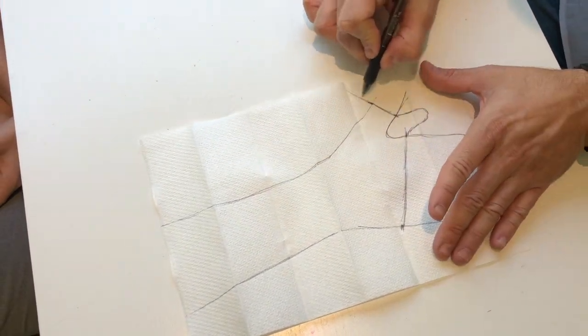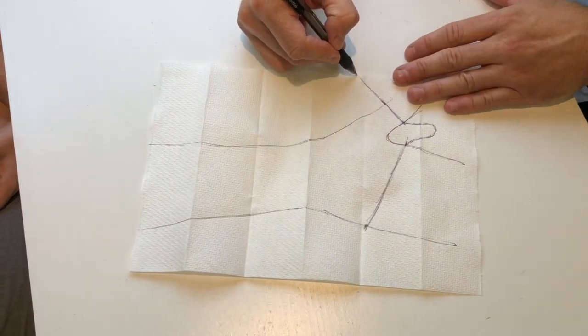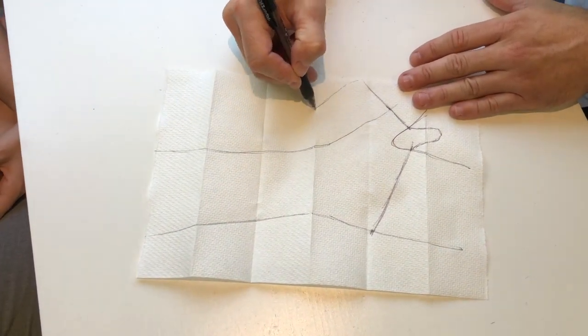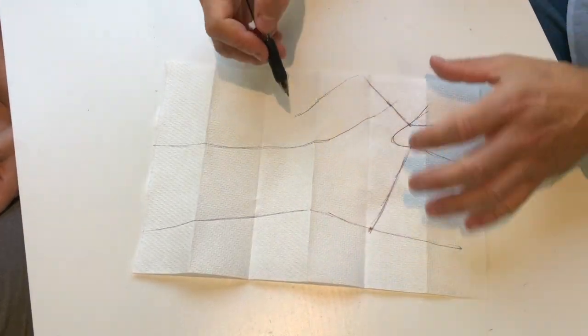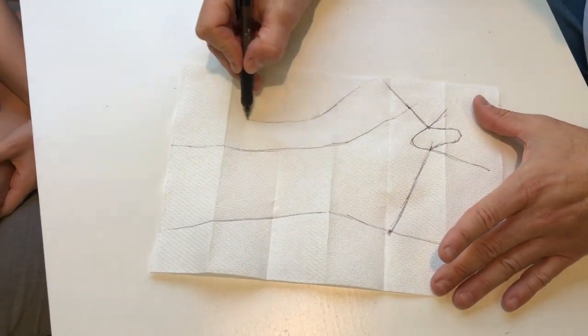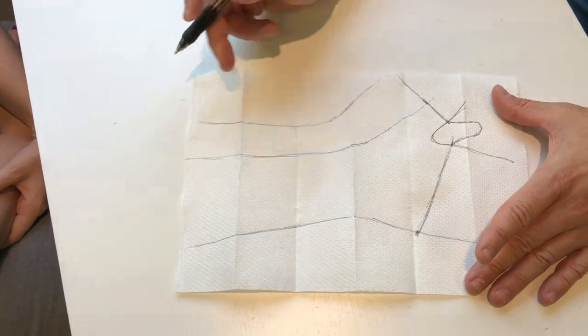Now, I like to extrapolate on the radial side a little bit more and keep that consistent the whole way. Don't bring it too narrow at the wrist, that'll affect the stability of our splint.